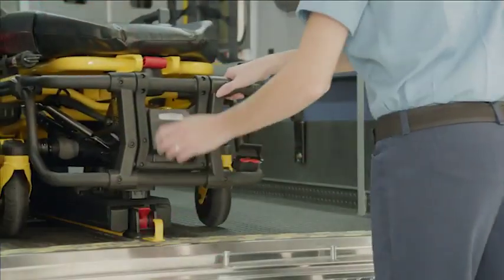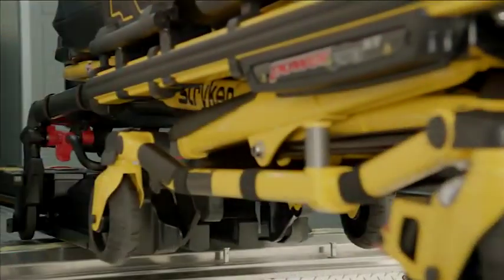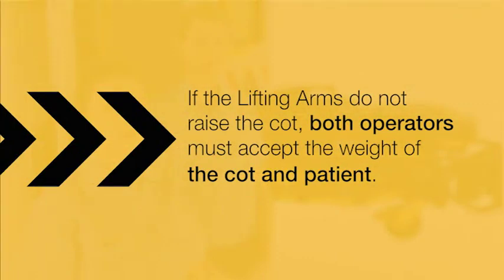As the cot is removed, the lifting arms will slightly raise the cot to accommodate patient weight and prevent the wheels from interfering with the rear sill plate. If the lifting arms do not raise the cot, both operators must be ready to accept the weight of the cot and patient.